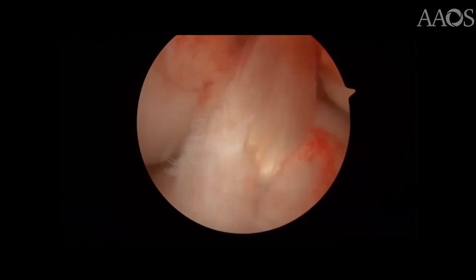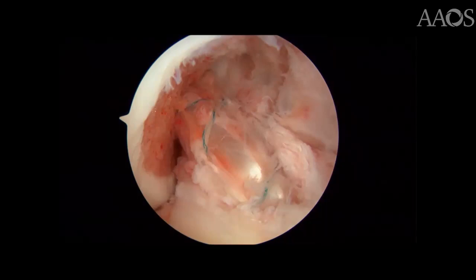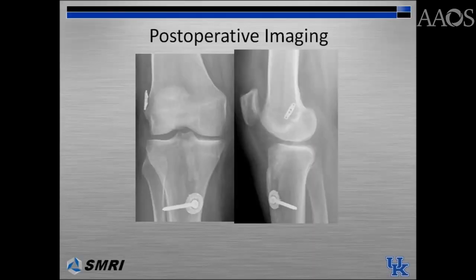Final arthroscopic pictures after passing the graft show good placement of the graft within the native anatomic ACL footprints. Postoperative imaging shows anatomic placement of the femoral and tibial tunnels. For femoral fixation, a cortical suspensory device was used. On the tibial side, an interference screw was used for primary fixation and back-up fixation was achieved using a bicortical large frag metal screw with a washer.